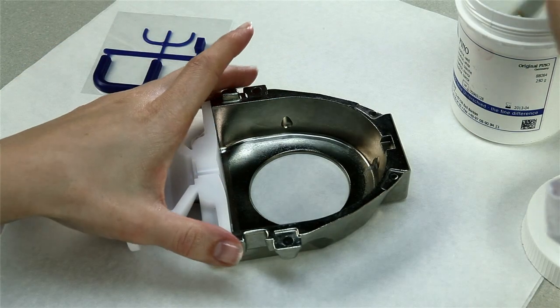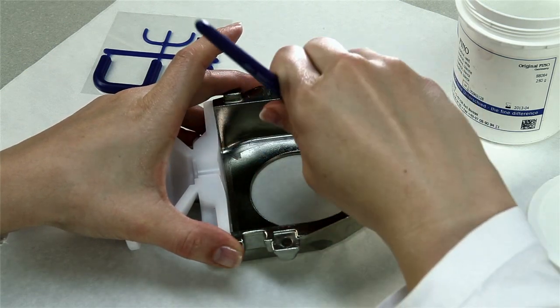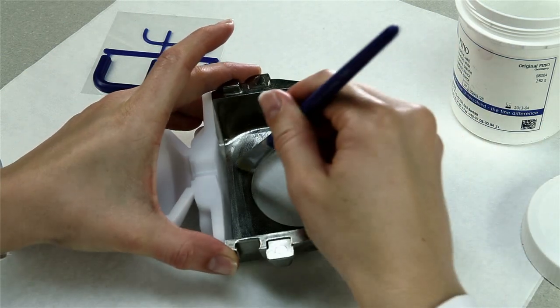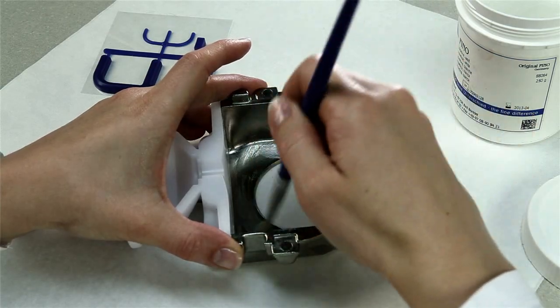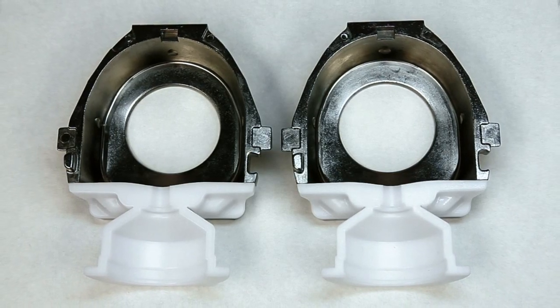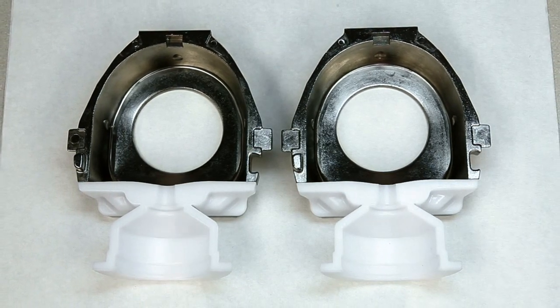To prepare the flask, coat the inner surfaces of the flask halves with a thin layer of petroleum jelly. The two flask halves are identical. Both can be used for model investment and for the counter model.